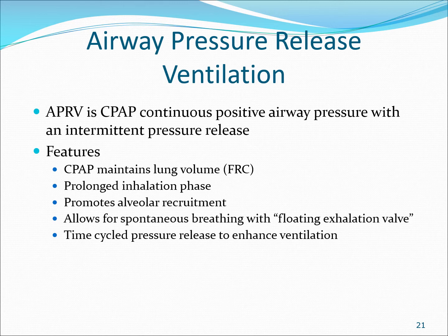When you breathe spontaneously, there are so many benefits of this. I do a whole lecture on spontaneous breathing. And this is time-cycled pressure release to enhance ventilation. So you're going to see the graphs, but these are the basics. Increased FRC, prolonged inhalation phase, promotes alveolar recruitment, and you can spontaneously breathe. Beautiful, beautiful concept.